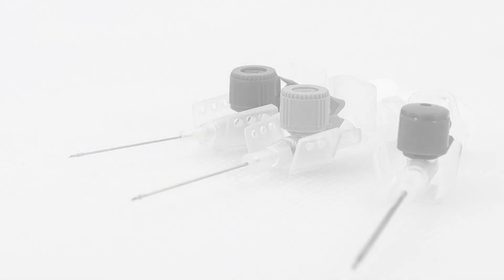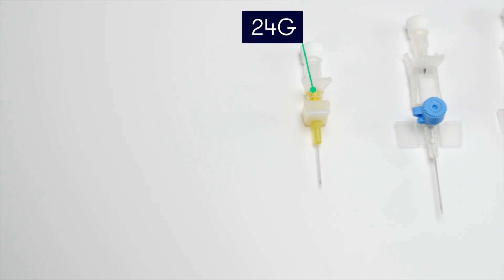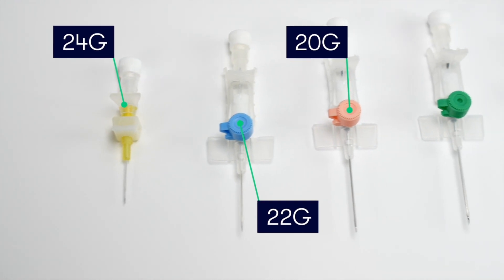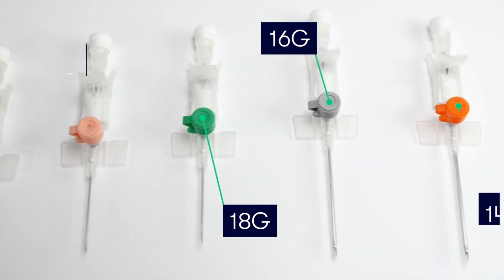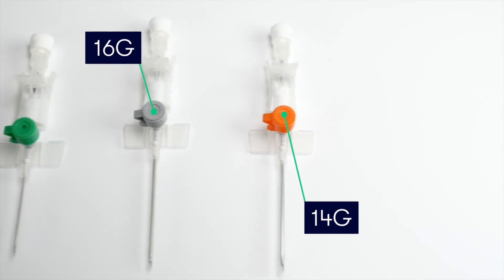Cannulas come in various sizes, with differing cannula lengths and lumen diameters. The sizes range from the very small 26 and 24 gauge cannulas, which are typically used in paediatric cases, to the largest adult cannula, which is the 14 gauge. As you can see, the different sizes of cannulas are easy to distinguish because they are different colours.